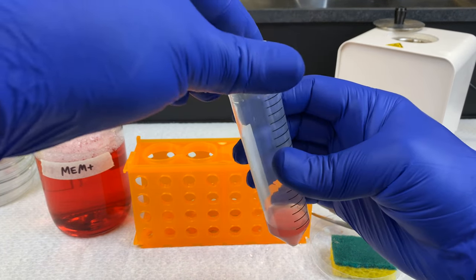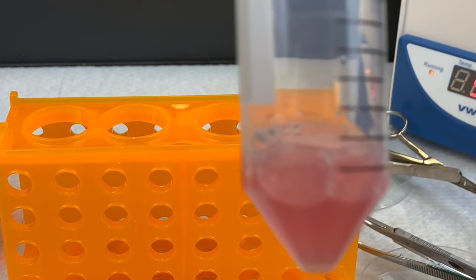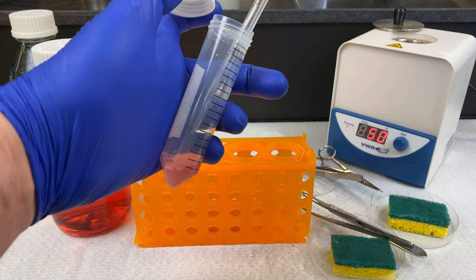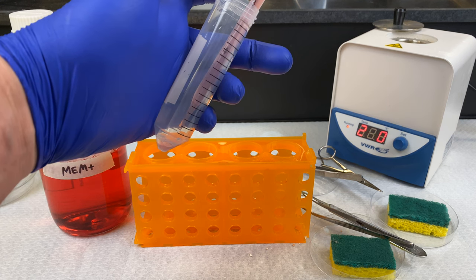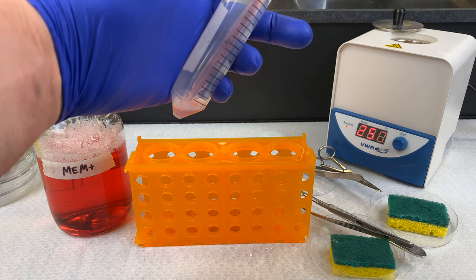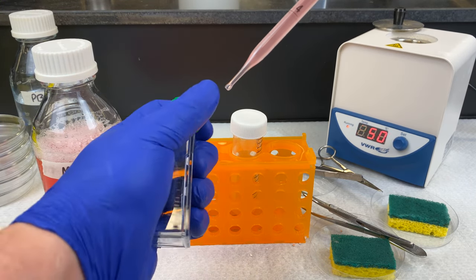We can now discard the strainer into biohazard, and here we have a nice slurry of liver cells. The protocol is now complete. We will now seed directly from the 50-mil conical tube into a few of our T25 flasks. The concentration of cells in that 5 mils of media is very high. As a result, you don't want to add too much, or else you'll create a biofilm and the cells will just cover the surface of your T25 flask and will not grow effectively.